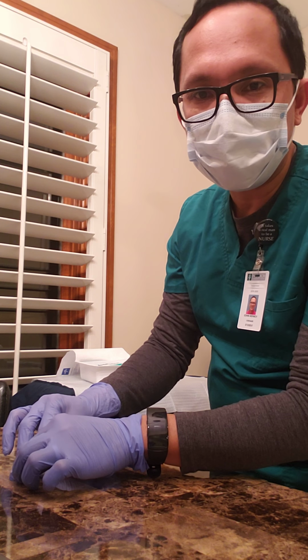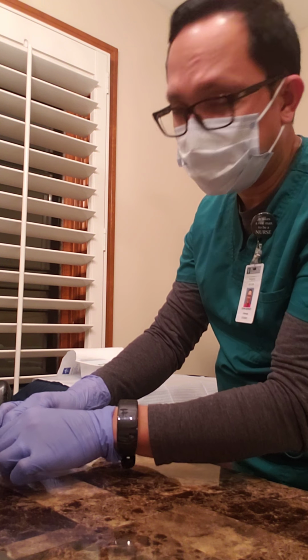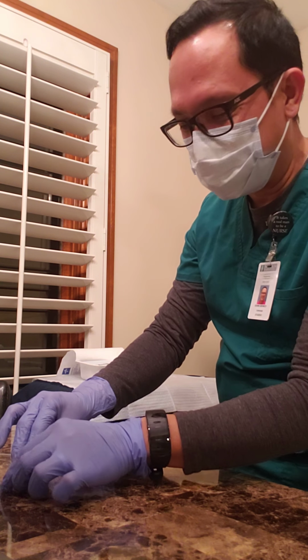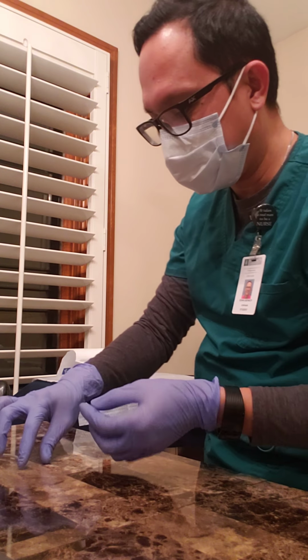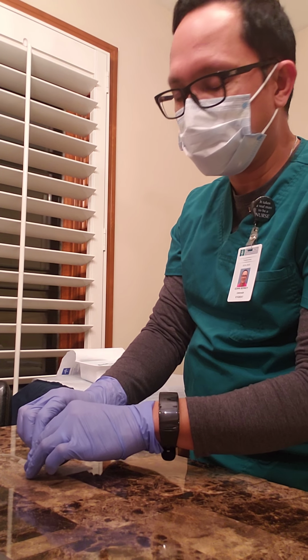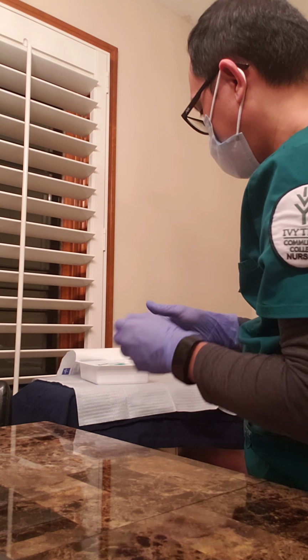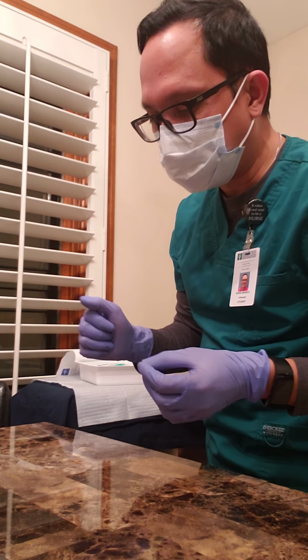I am just going to pretend as if I'm taking out the dressing because I ran out of dressing already. I'm sorry, Professor Pippin. Okay, at this point in time, I've taken out the transparent dressing already. I'm just going to dump it in a proper bin, a receptacle.